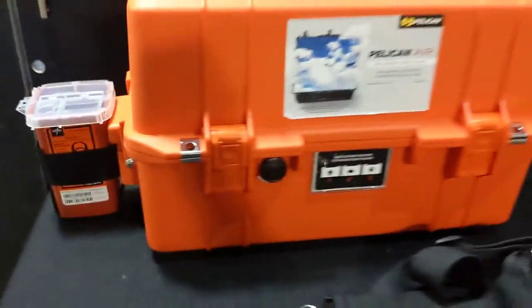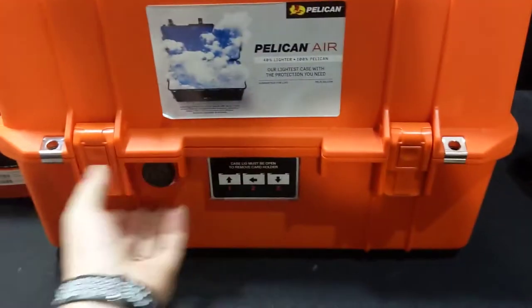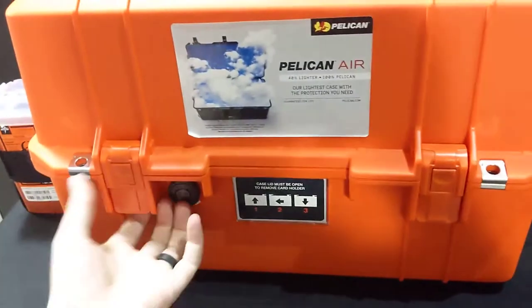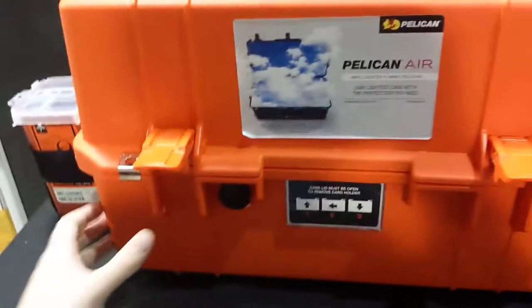This is really great for an event medical clinic where you're going to have this set up on a table, ready to go. It's a great organization system that makes things easy and secure to pack up at the end of the day. It's great for an outdoor environment because it's waterproof, dustproof, and drop-proof, and it's going to hold things really well in transport.